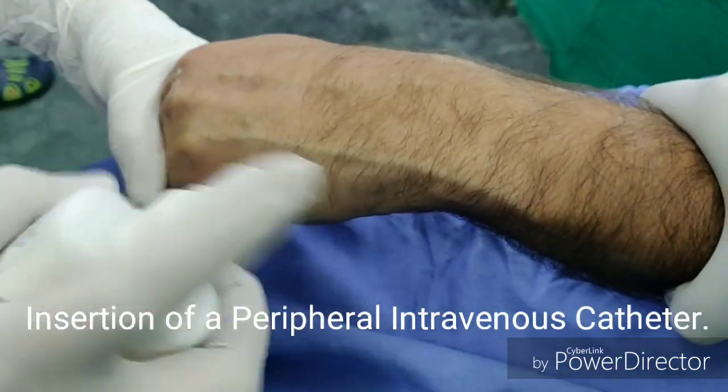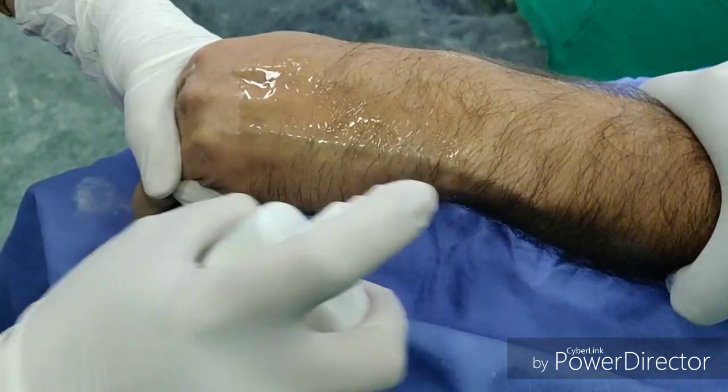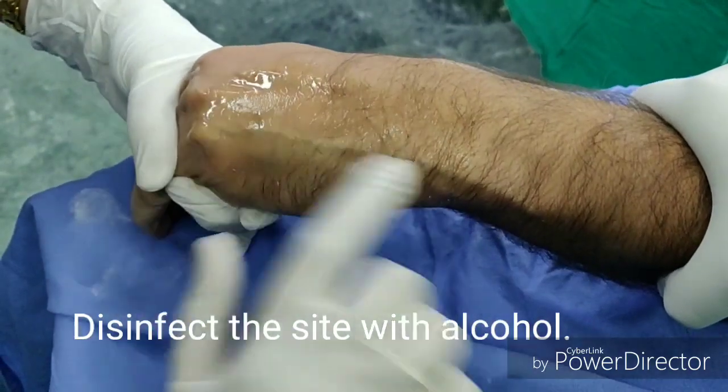Peripheral IV catheters are the most commonly used intravenous device in any hospital. A tourniquet is applied just a few inches above the site of IV insertion to make the vein prominent.